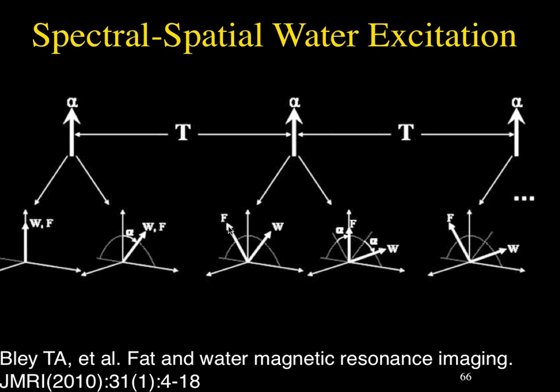If at that particular time you put in another alpha pulse, fat is swung all the way around to the other side, then if you do an alpha pulse again, you'll rotate the fat back up into the z-axis, and you'll rotate the water farther from the z-axis. And then here's a situation where the rotating bulk magnetization vector now is all water, and fat is no longer rotating. It's just in the z direction. So here, all the signal you would get would just be from water.